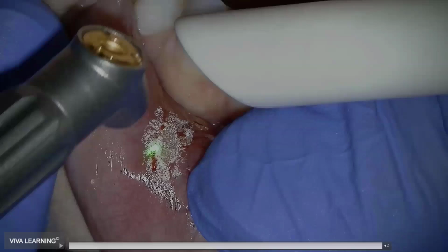And then just one more quick question: is there any heat generation, like pulpitis? Interestingly enough, that was a question they had to answer for the FDA to get FDA approval. They literally had a tooth, fired the laser at the tooth, and embedded in the tooth was a little thermometer to show that the temperature wasn't increasing. So that's kind of a misnomer of CO2 lasers, that you're burning up pulps. Absolutely not. That's never happened.